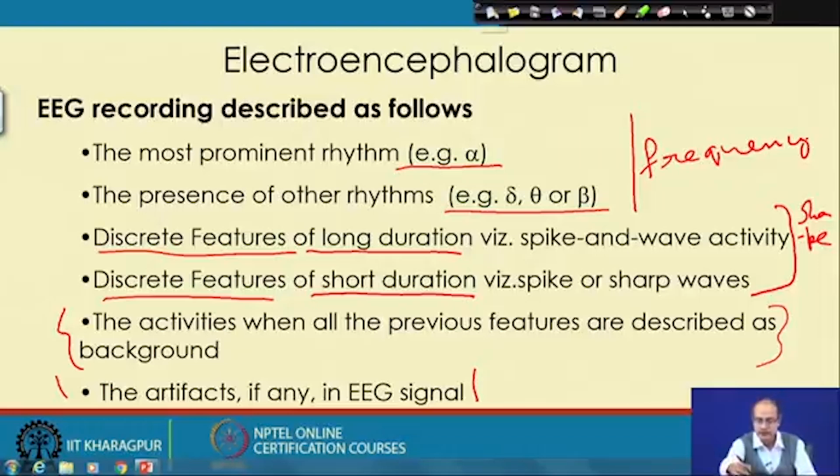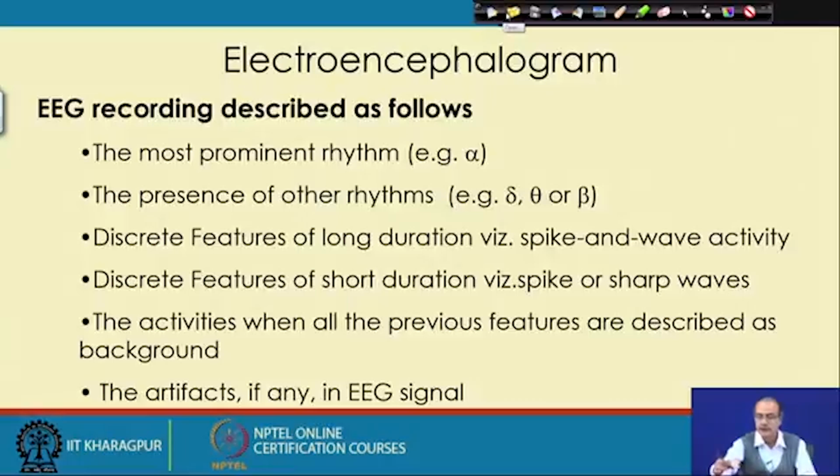So, this is a short description about the EEG signals, which will help us go to the next stage, that is, how to identify some of them, which is required for the reporting of EEG.